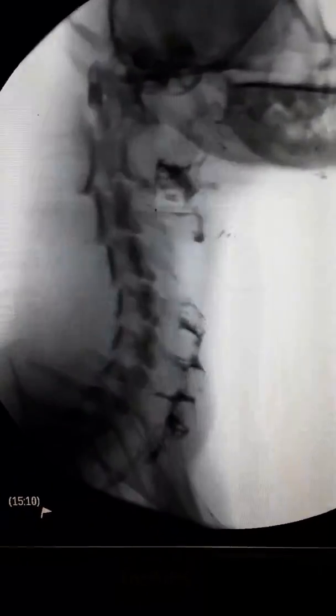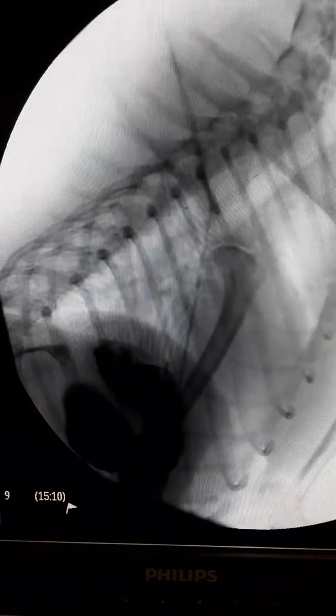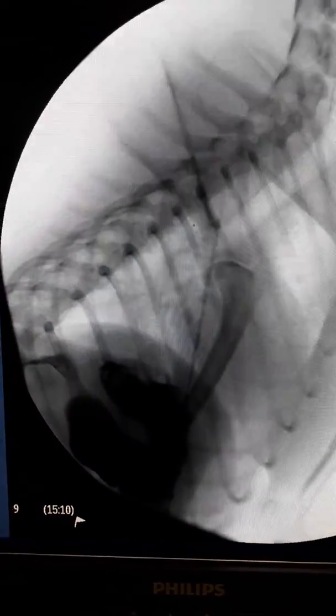We then followed with some kibble. She swallowed that pretty well, though some of it did get hung up in her neck. It took another swallow of food to get things moving, but it moves through pretty well, pushes some of that remaining material in the esophagus through and immediately into the stomach.